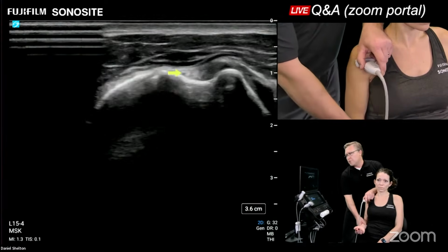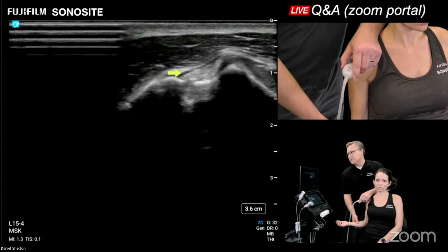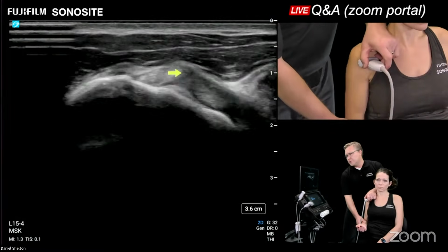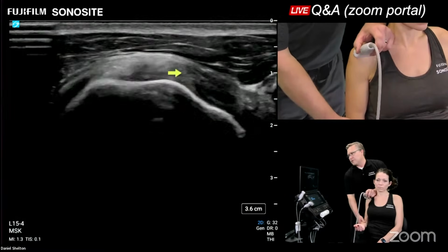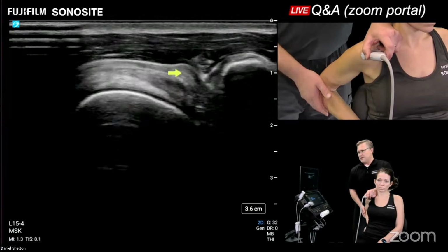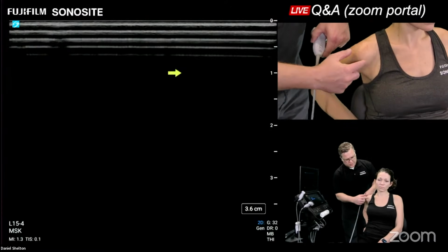And that's really important when we're trying to chase our lateral rotator cuff structures like the supraspinatus. So we internally rotate the supraspinatus a little bit, come up further north so that we're on the greater tuberosity, bring the elbow back, and it can just set right there. And I haven't really moved my probe. I stayed right on the ball shape of the humeral head right there.